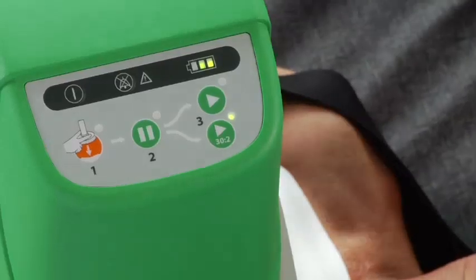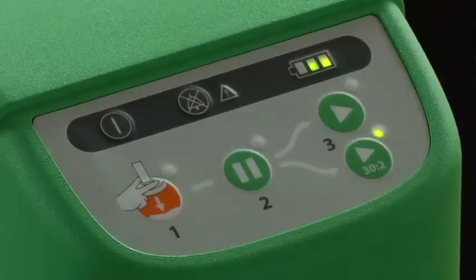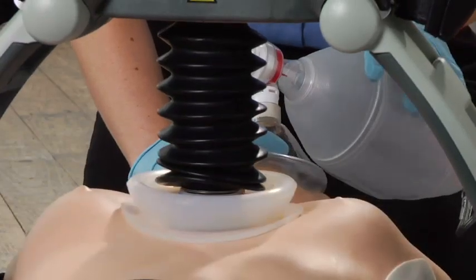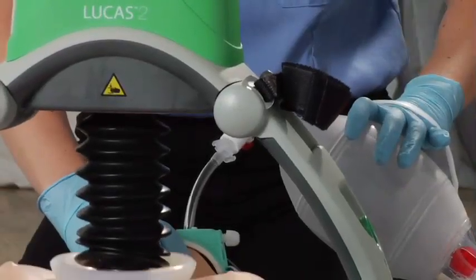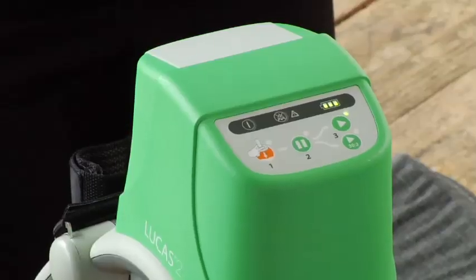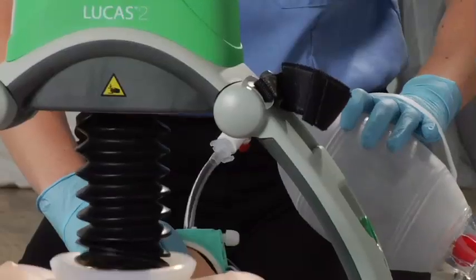If you are ventilating with a bag mask, use the active 30 to 2 button. After 30 compressions, Lucas pauses for 3 seconds to let you deliver 2 breaths, then resumes compressions for 30 more. Once you have an advanced airway, like an endotracheal tube in place, you can switch to active continuous mode and deliver ventilations without pausing compressions.